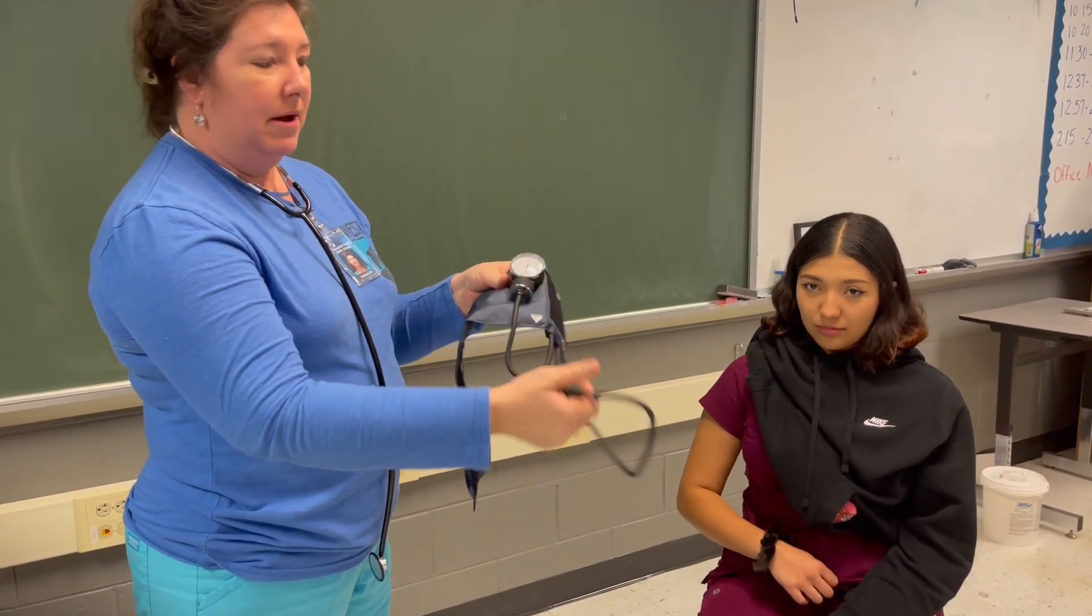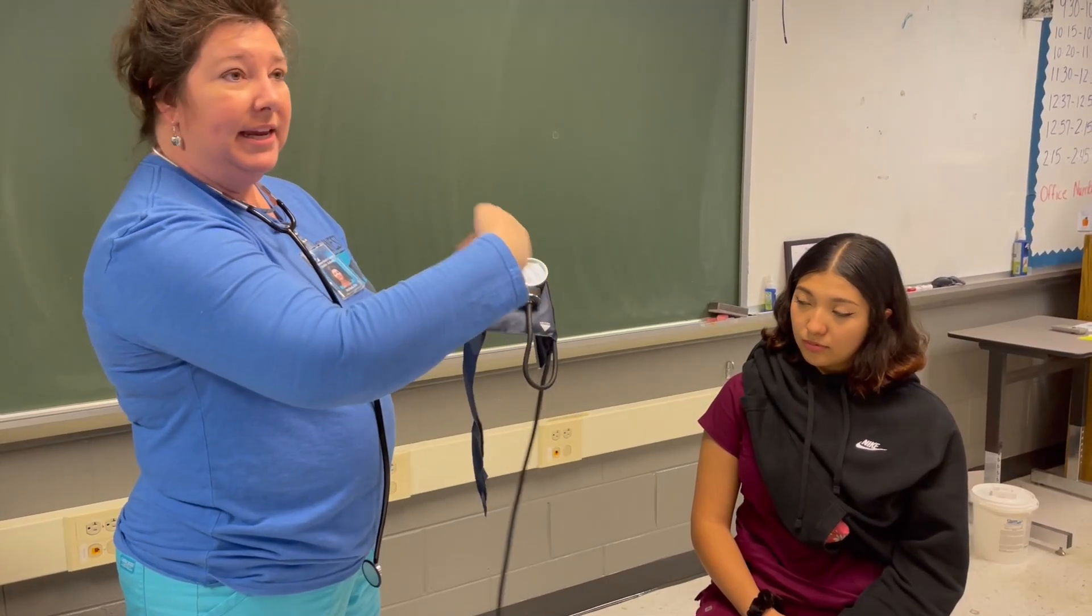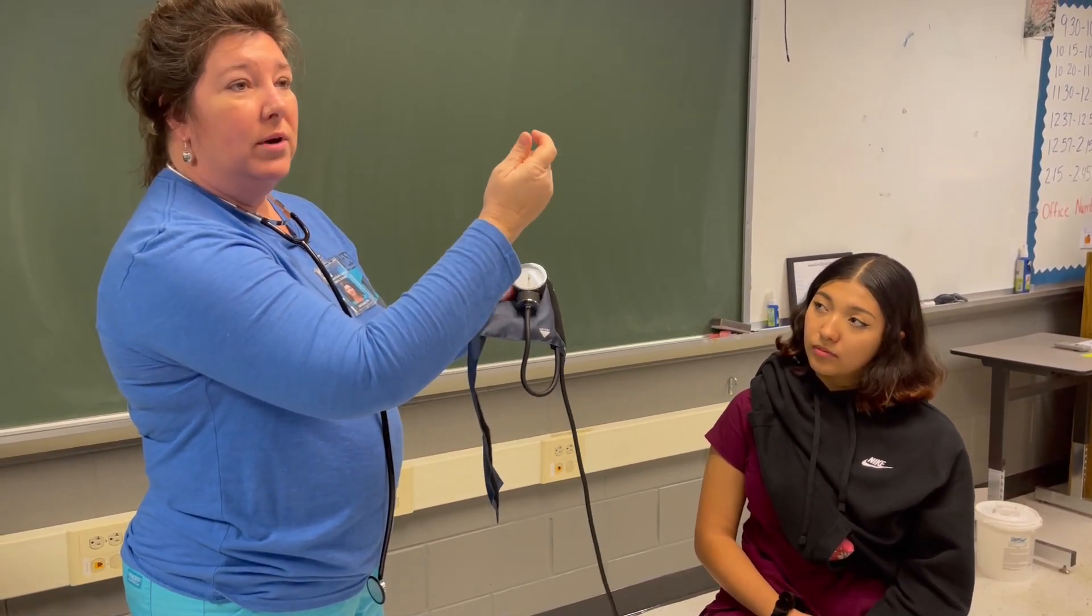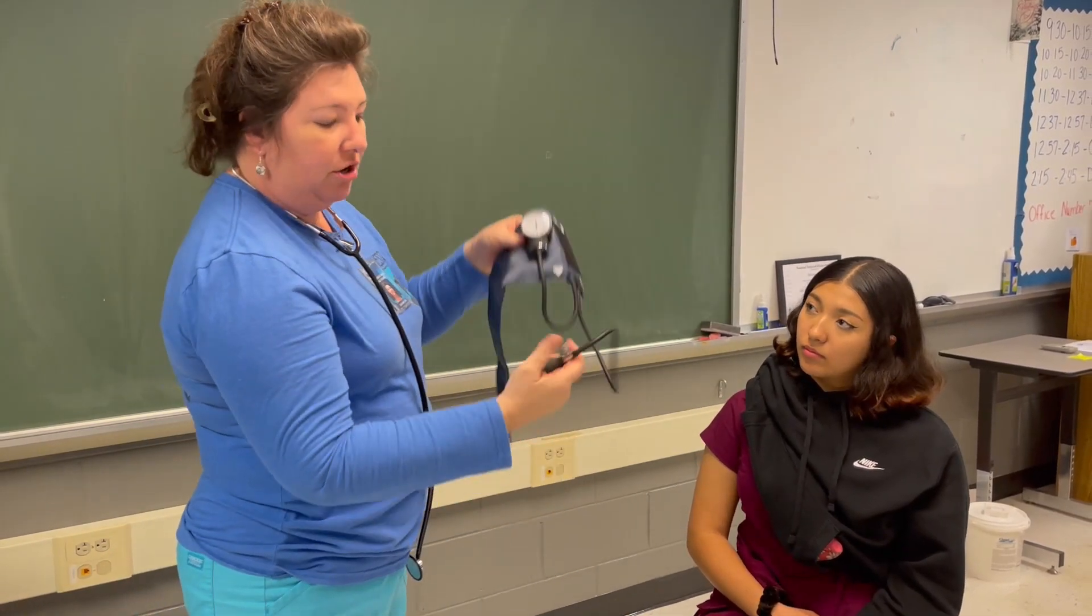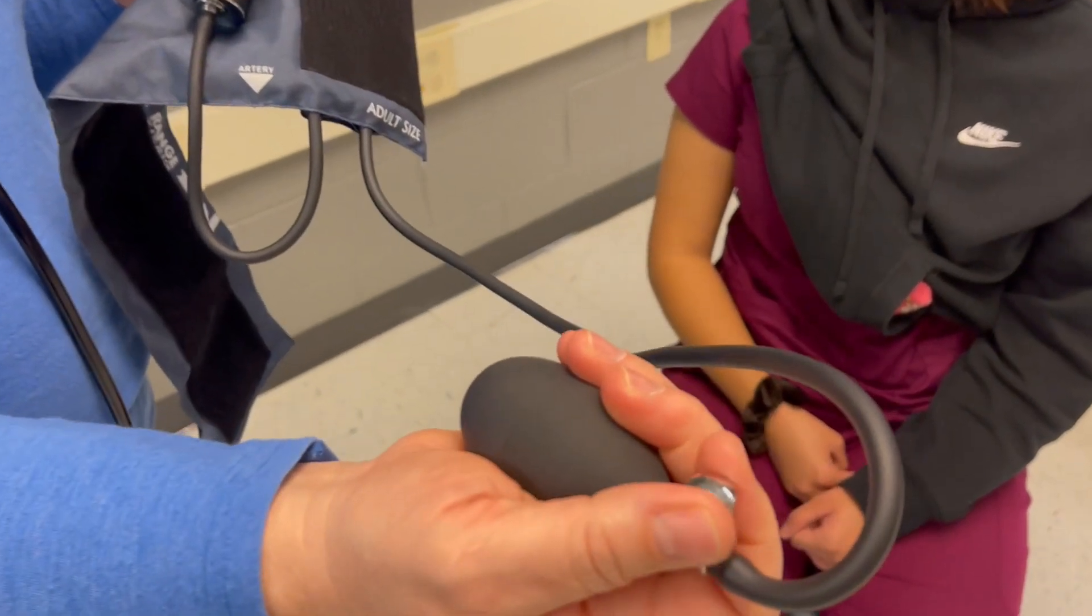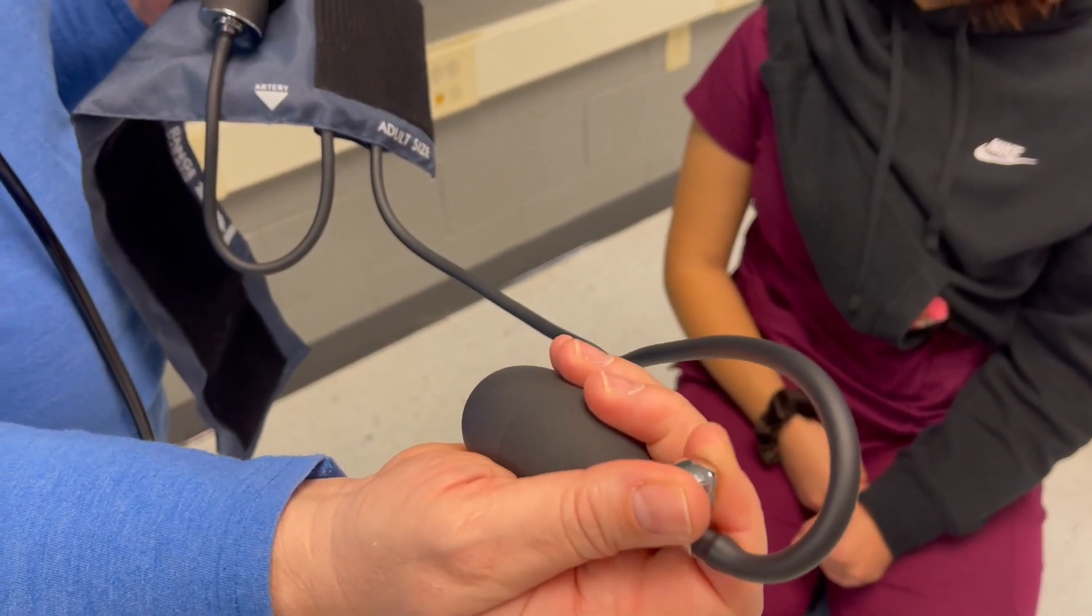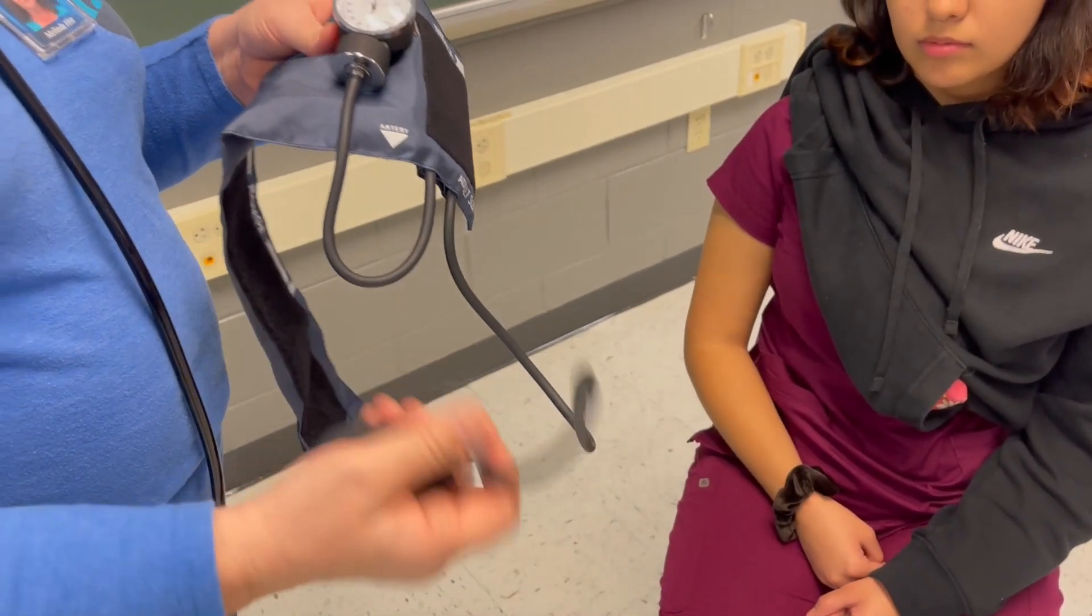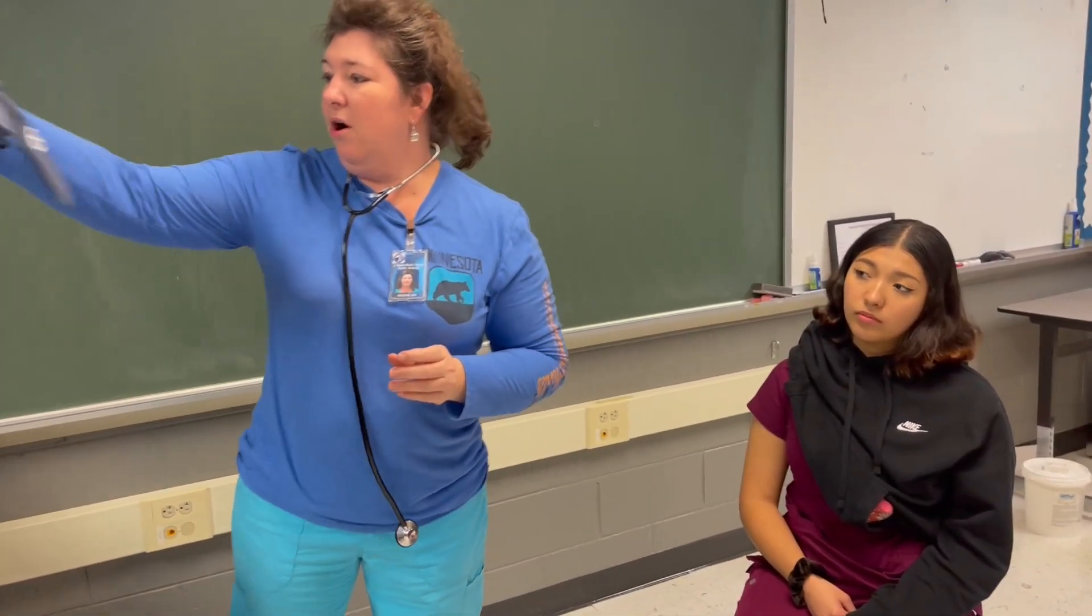When I take the bulb and I start to pump it up, you'll hear it in your stethoscope. When I slowly start to release this, you'll hear it hiss. You don't do it really fast. You do it very slowly, and at the same time, you're listening for the heartbeat.